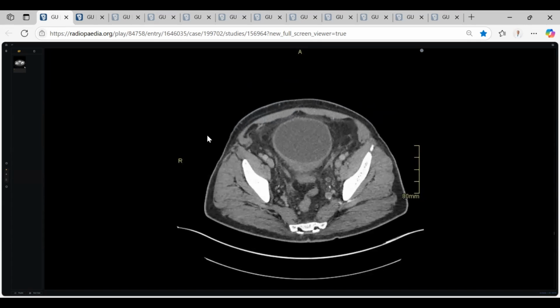It appears dilated. Can you ask for a control, doctor, or you can't? Yes, yes, I'll do that. Yes, please. It's better. I have requested. Go on. Yes, sir. Yes, go on.